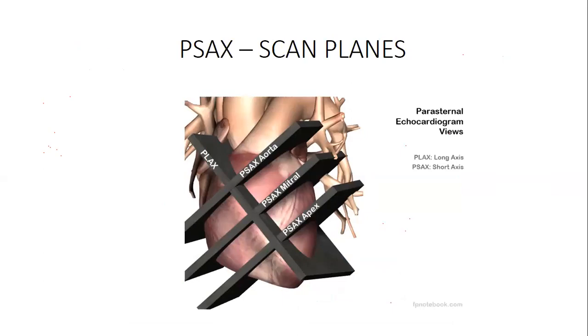Okay, I'm back. So when you look at this, this is the long parasternal. You are cutting your heart in the long section when you put your probe here. Remember the apex, when you put your patient in a left lateral decubitus, we justified that the heart becomes closer to the chest wall. So this part becomes closer. So when you put your probe here, you are cutting your heart in a long section.